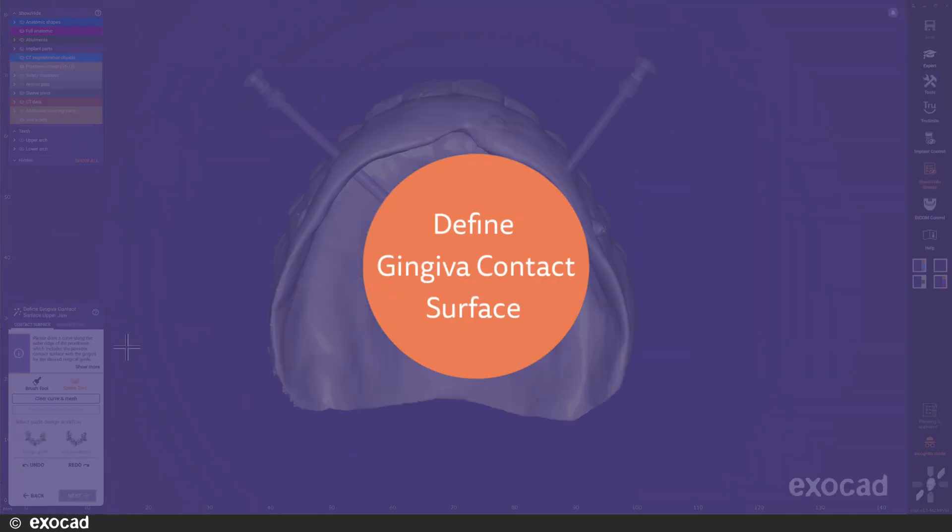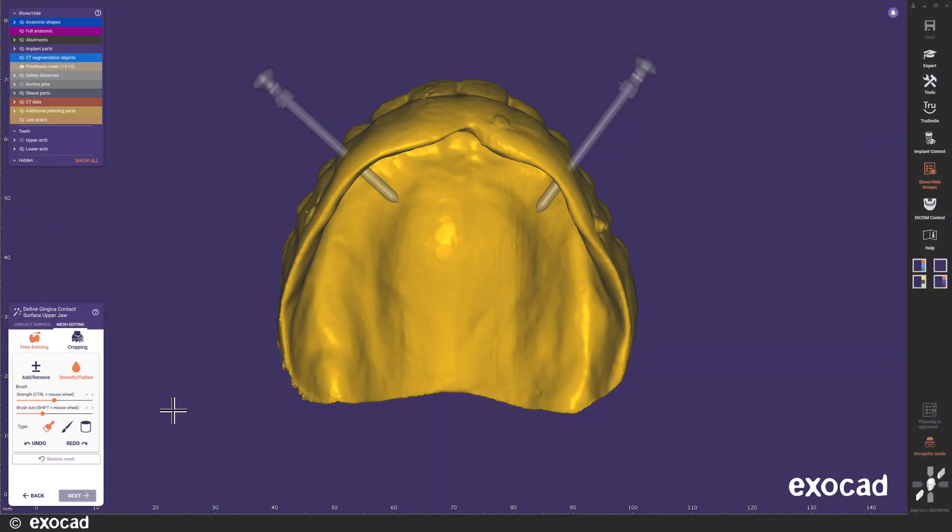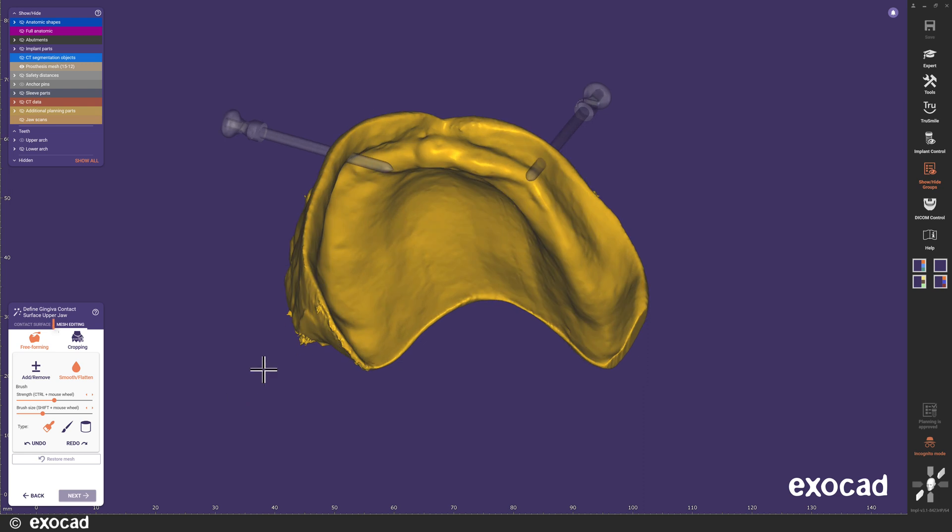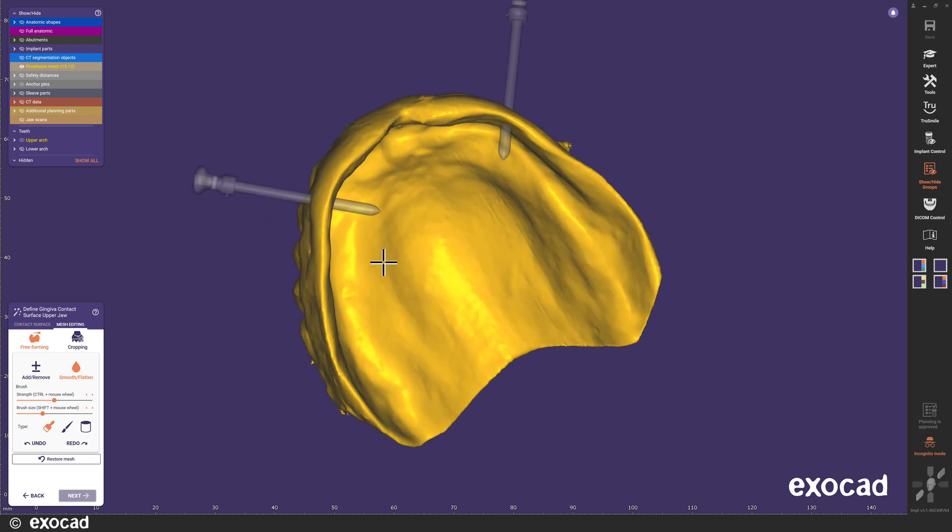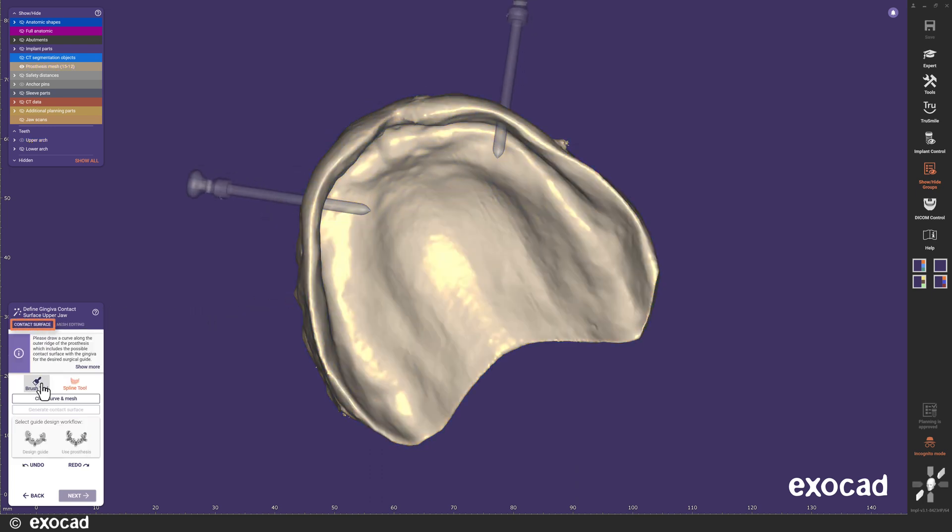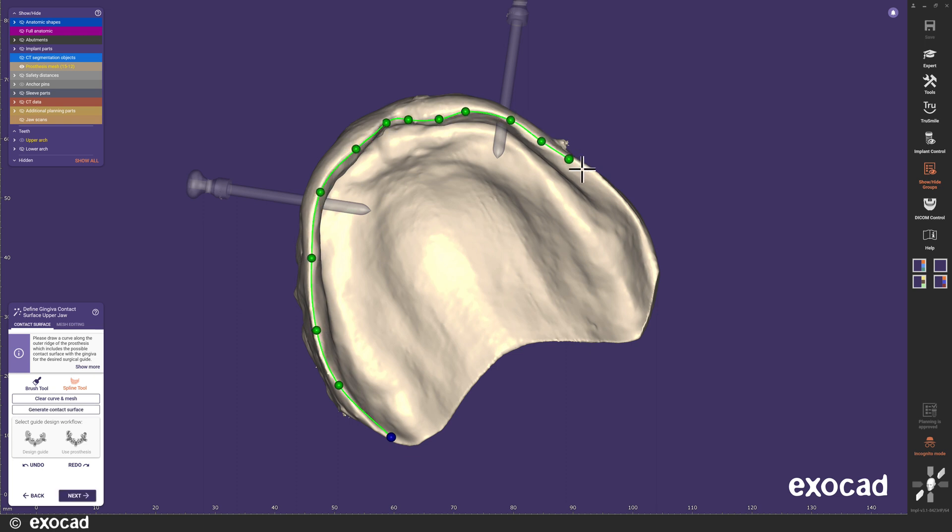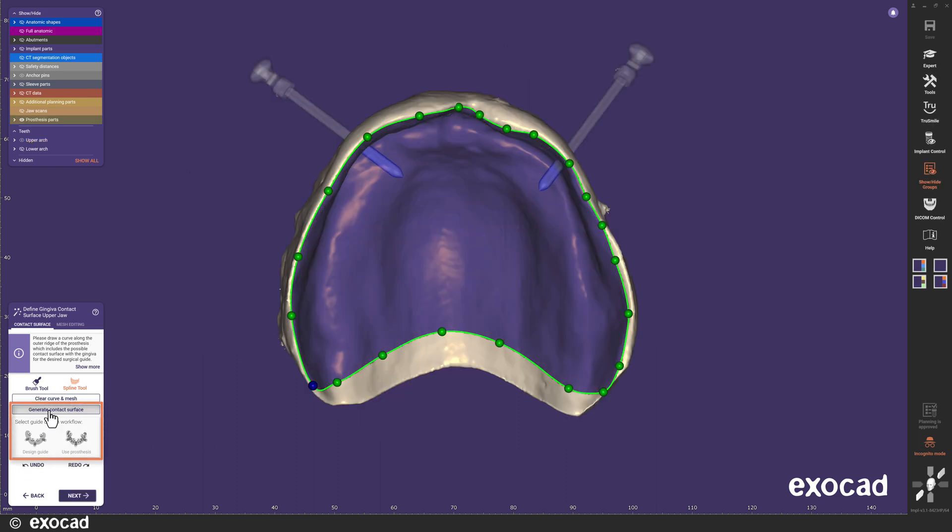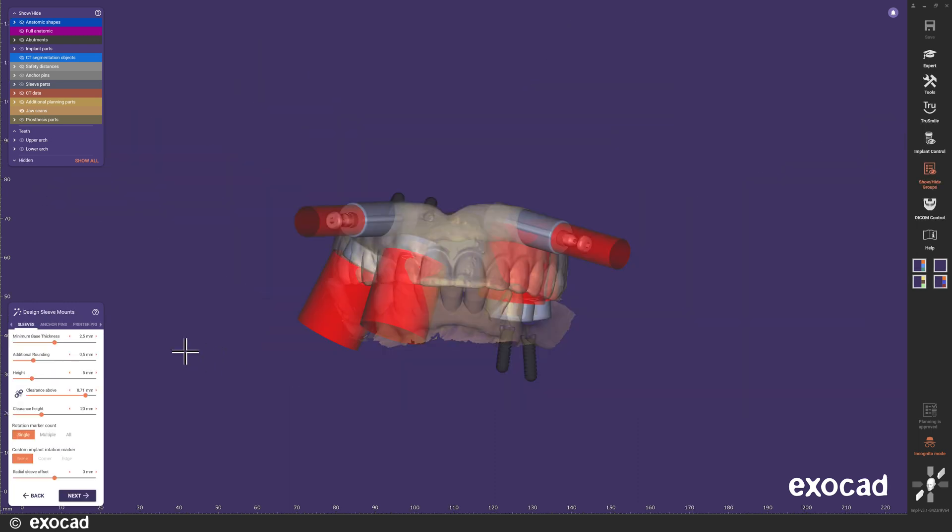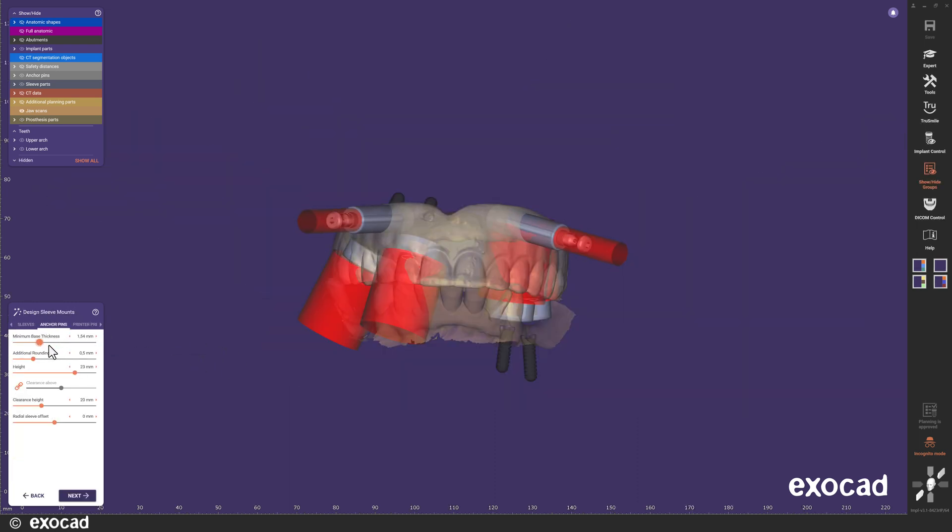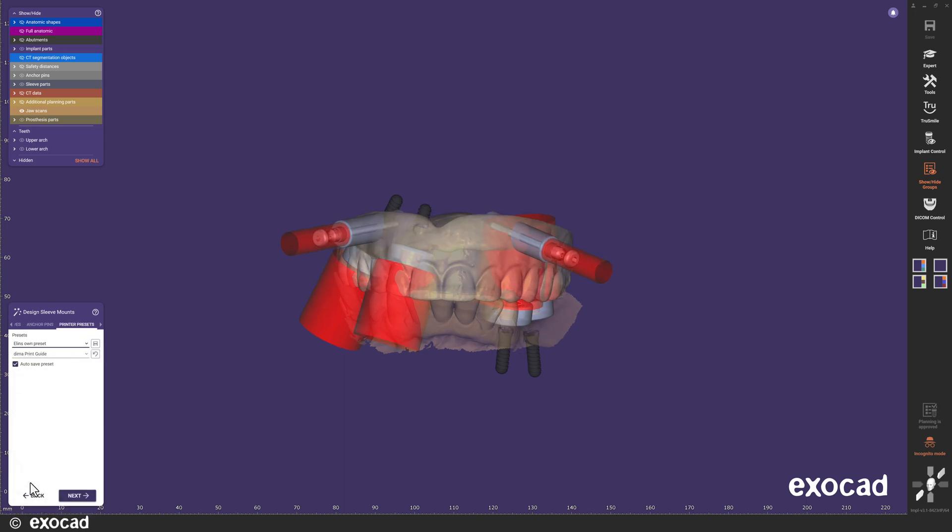The next step is the fine gingiva contact surface for upper jaw. Here I can start by using the mesh editing to clean up the generated prosthesis mesh a bit, since I will use this for my guide design. Of course, the mesh editing has the revised look also in this step, to simplify the use of free-forming and cropping. As I said, I will use the shape of the prosthesis for the design of the guide for the upper jaw. In this next step, design sleeve mounts, there is nothing new. I use the tabs to change the anchor pin mounts and apply printer presets.